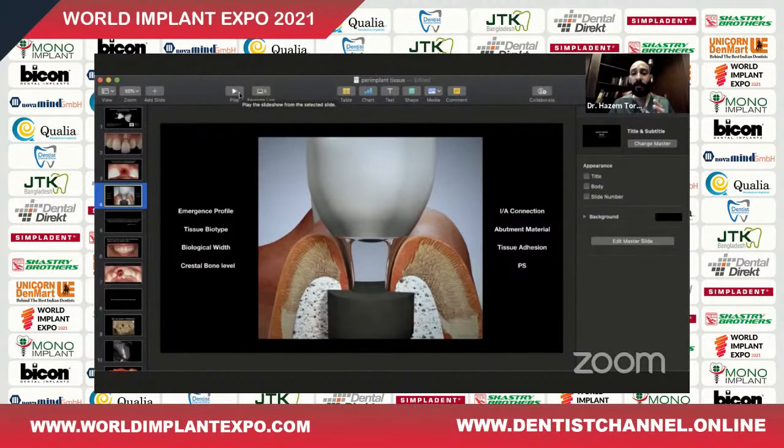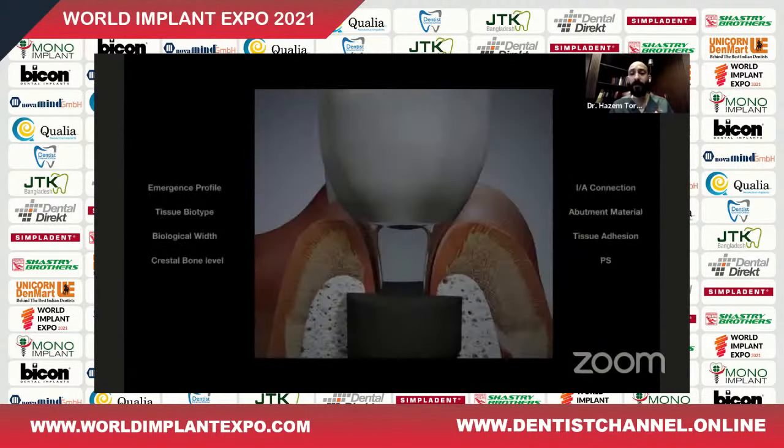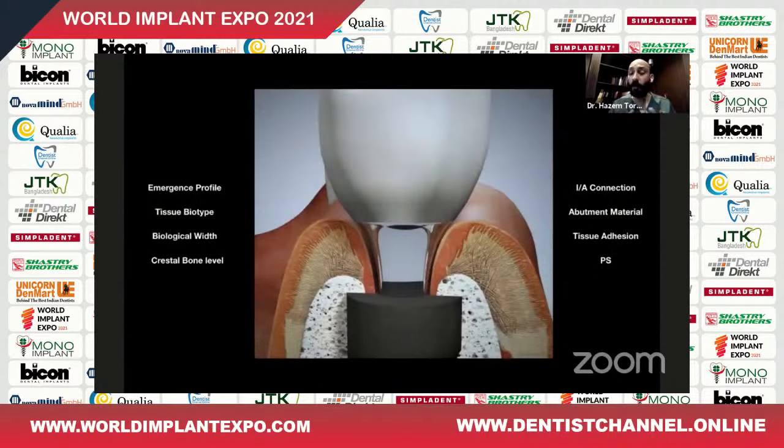What type of materials do we use today? Do we go for zirconia abutments, custom-made zirconia abutments? Do we go for titanium abutments? Do we go for PEEK abutments? There are a lot of choices today, and it only makes things more critical and more complicated because we have to make our decisions very carefully.